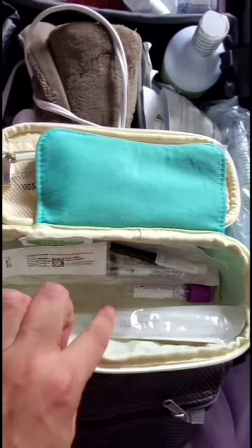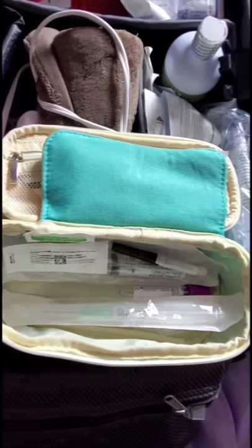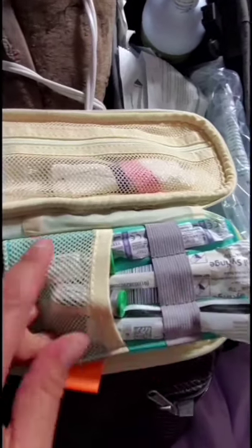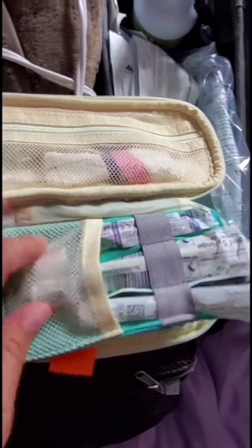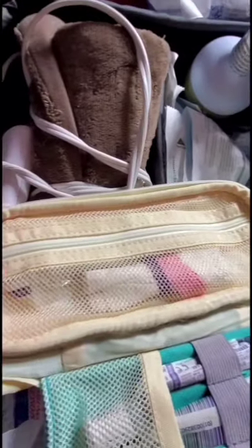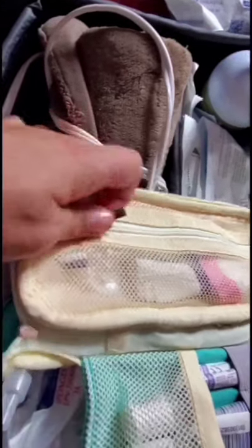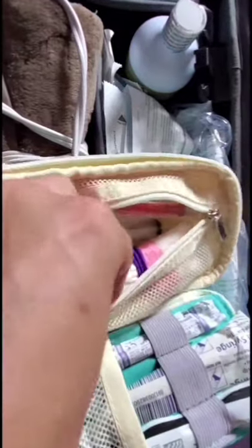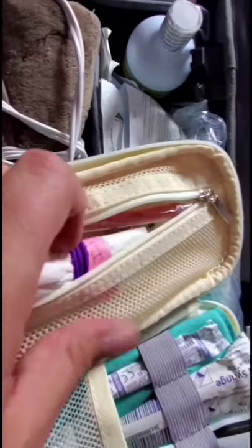I have what I need for blood collection, so if we have a PPH and we're heading in we can collect the group and screen quickly. I've got my extra oxytocin to throw in a bag, and syringes so we can do extra oxytocin IM as well. Zipped in the top, kept separate from other meds, I've got my adult epinephrine — they come in glass ampoules wrapped in paper towel and clearly labeled 'epi'.